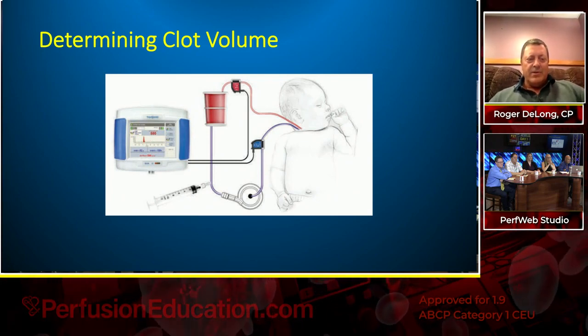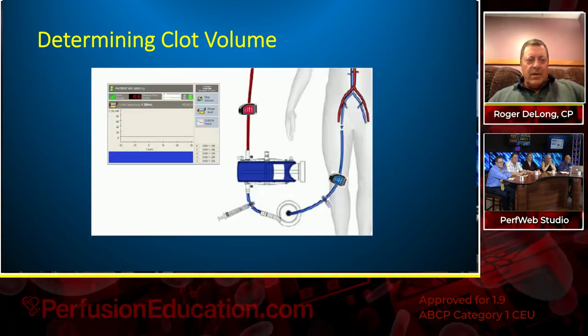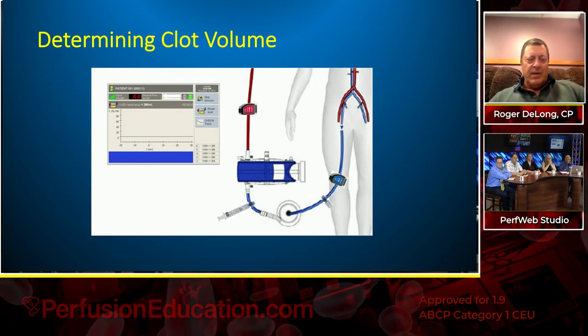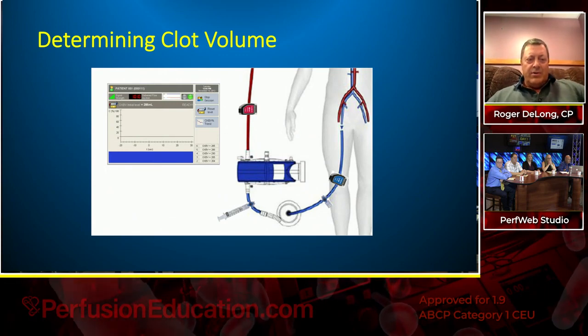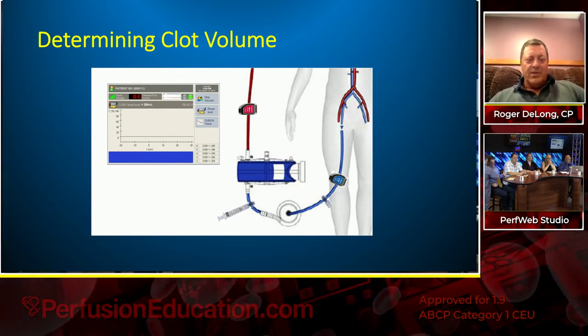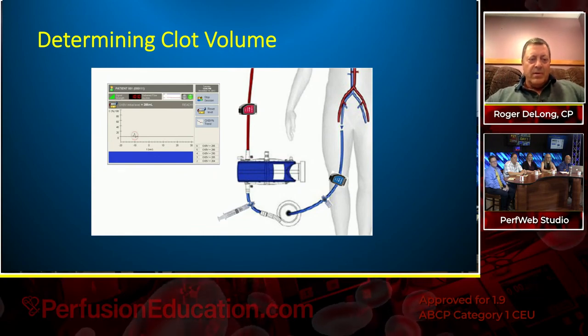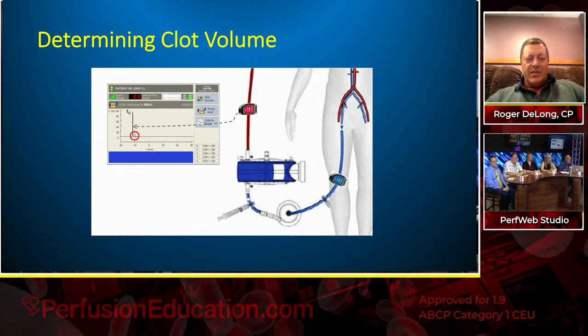Next picture. All right, and here's the injection port, and it's just a room temperature saline upstream, and the arterial sensor just downstream from the oxygenator. Oh, thank you. Right? Well, not next picture. Make it run. Here you can see the injection of saline.